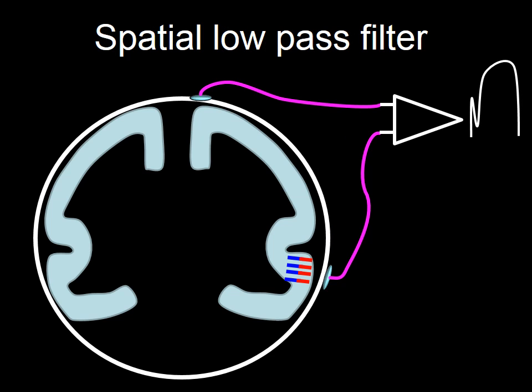Widely spaced electrodes, as we encounter when using common electrode reference montage, because of the longer inter-electrode distance, most of the time behave like spatial low-pass filters. They de-emphasize waves that arise from one electrode and emphasize waves arising from many electrodes.